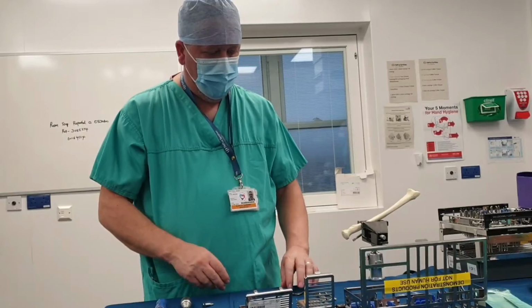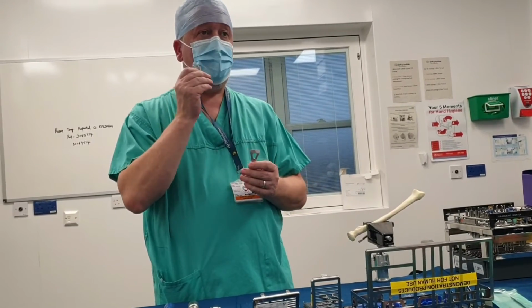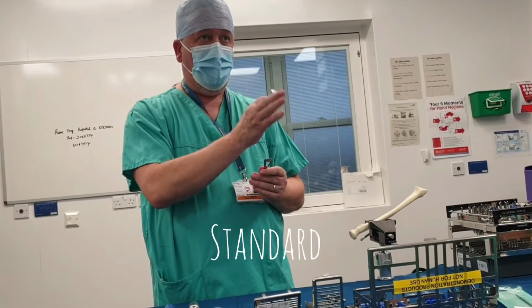But apparently, other systems need to use the 2.7 shaft screw, and that's why most surgeons are so used to using a 2.7 screw for the shaft. But apparently, in the Depuy Synthes distal radius system, it's not necessarily the case. You can safely use a 2.4mm screw for the shaft. What they will do on your sets is have different sizes. So you have narrow, standard, wide.